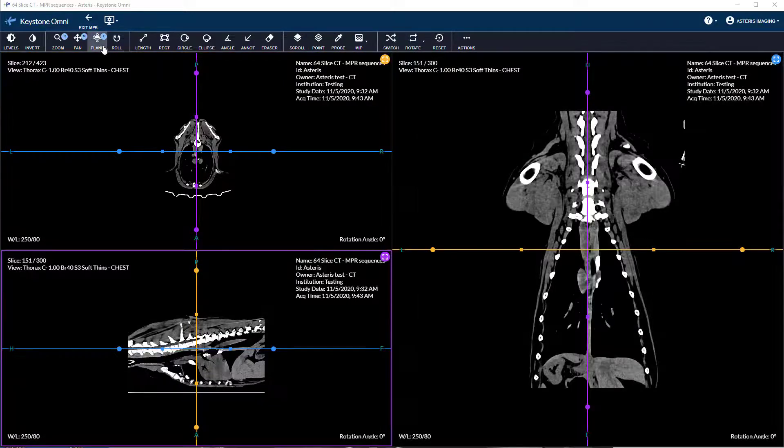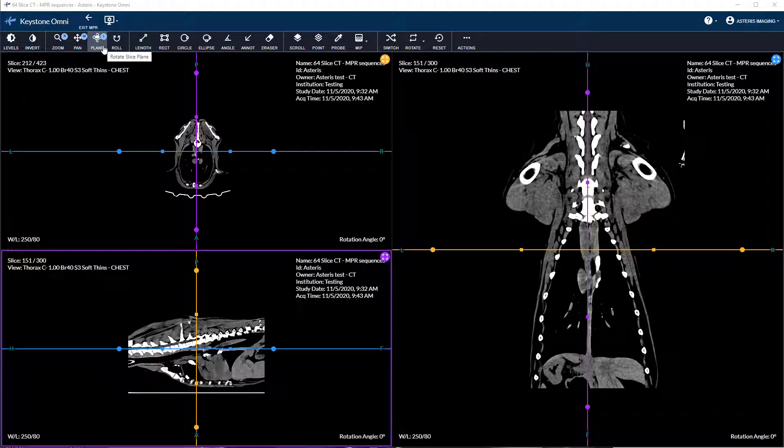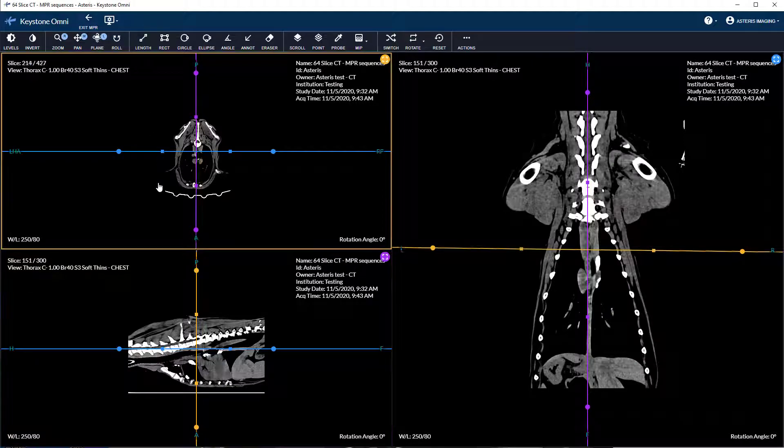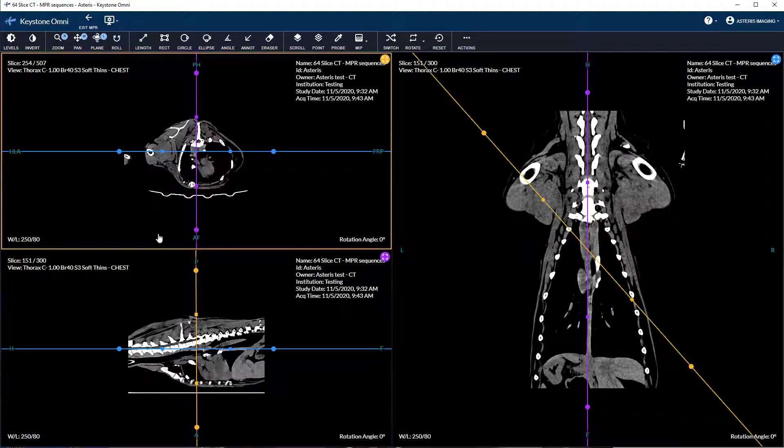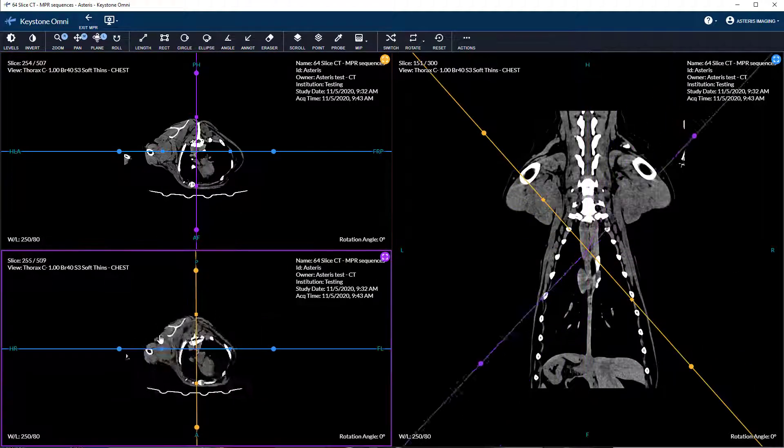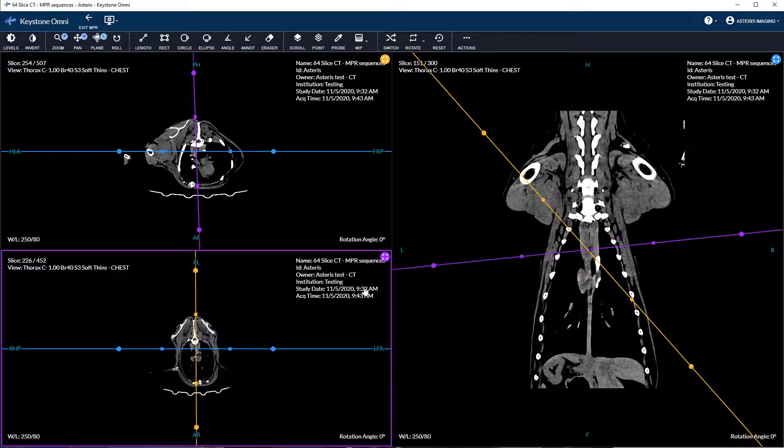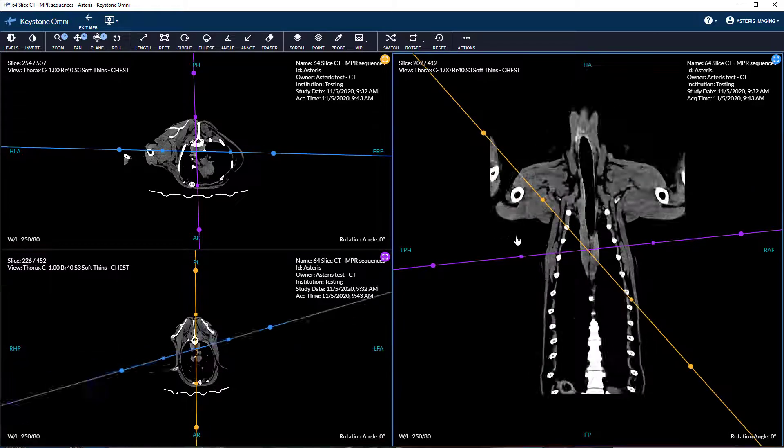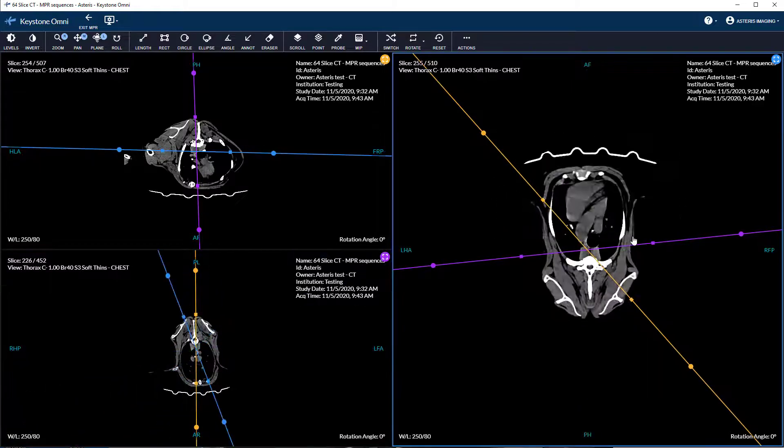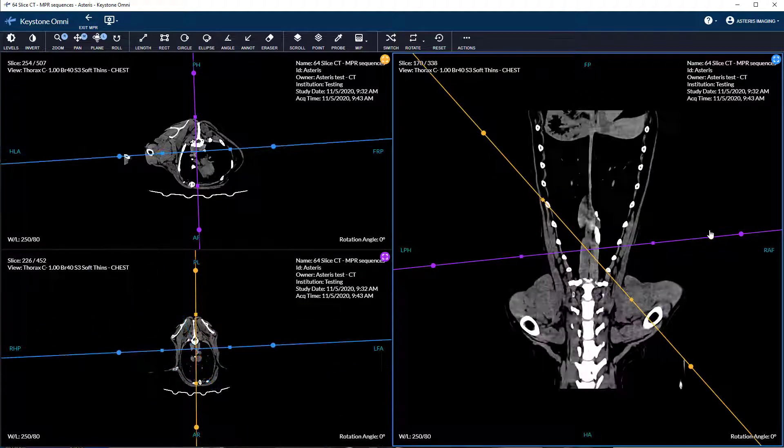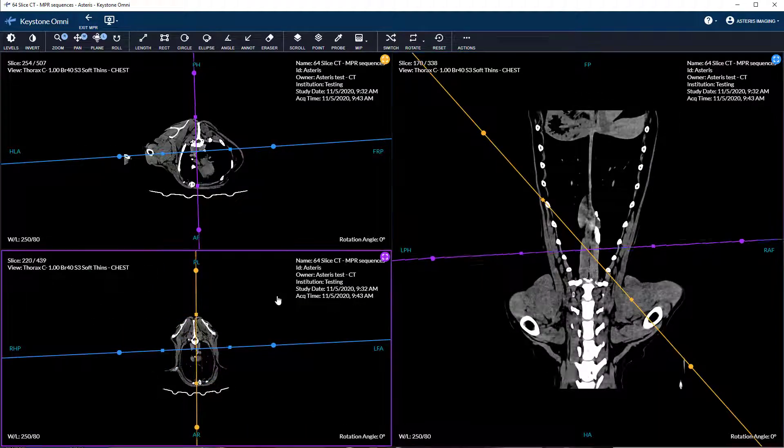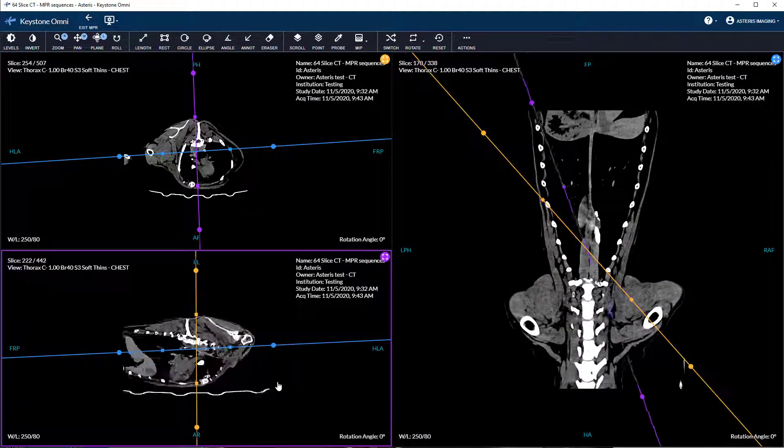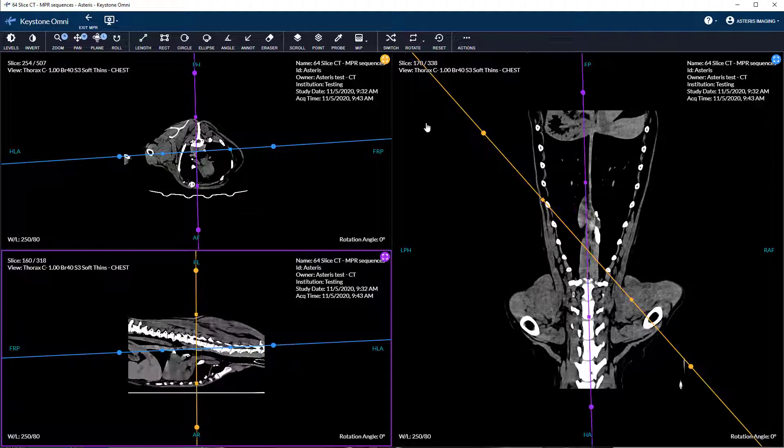The plane tool provides horizontal and vertical rotation across the active slice plane. Click and hold the configured mouse key within the highlighted viewing pane to rotate the desired axes.